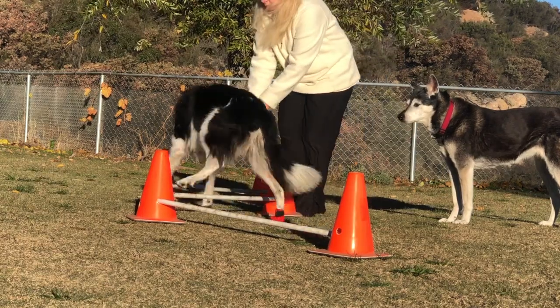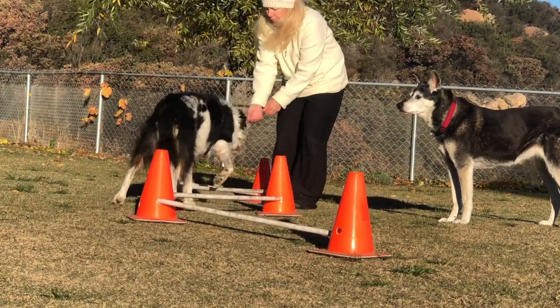Twix has recovered a lot more since this video was shot back in November of 2018.